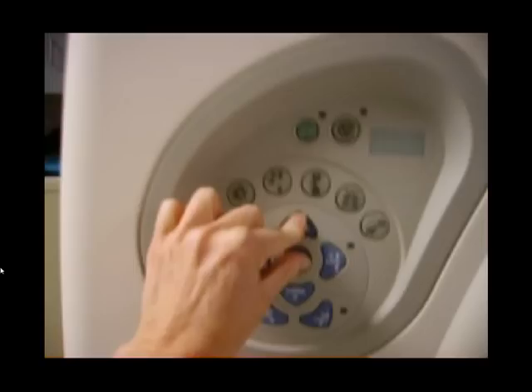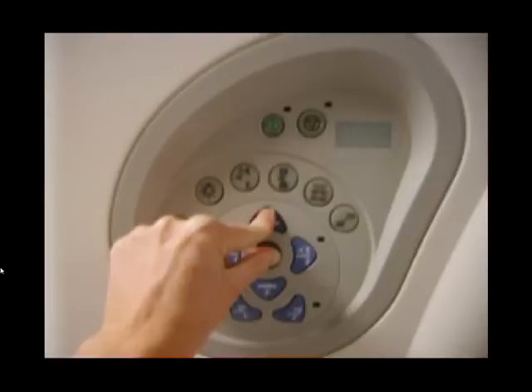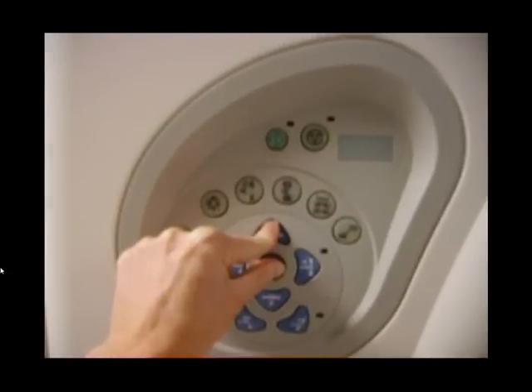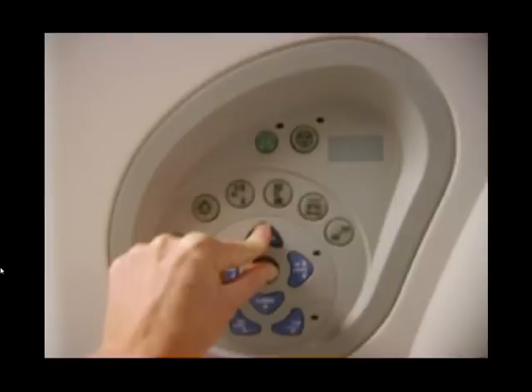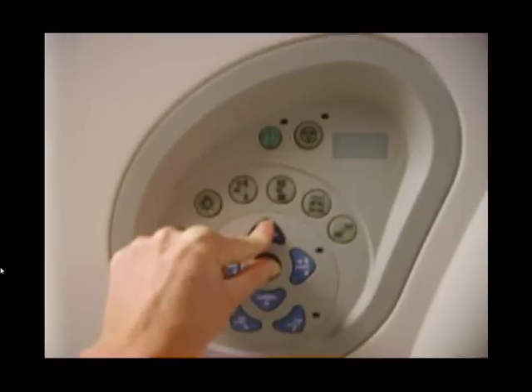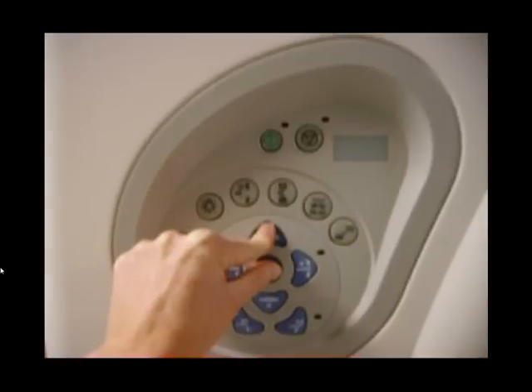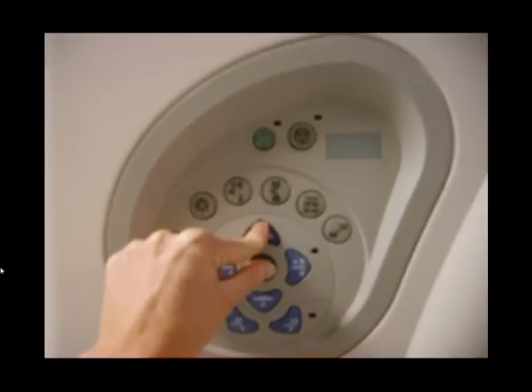Now we're going to move our patient in. Again, these are the two buttons that you're going to push to move your patient in. This makes the table move faster. We talked about what each button does in the last lesson, so I'm not going to go over that, but I just wanted to show you a bird's eye view of what you would be looking at.